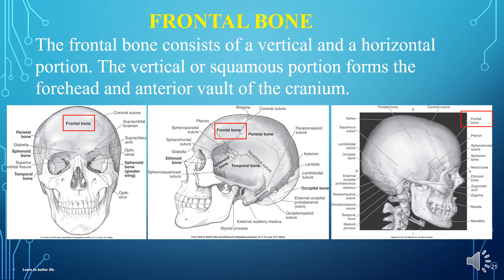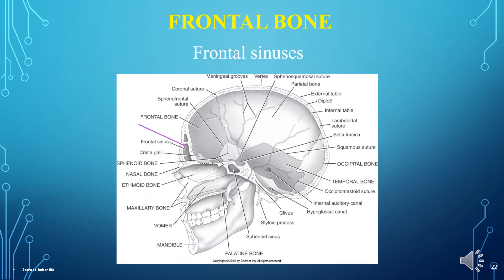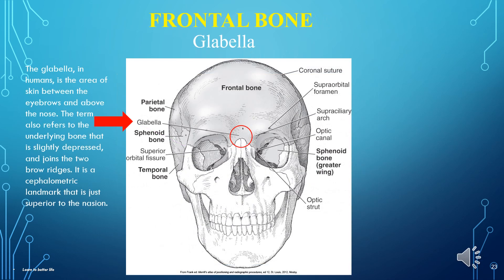Let's look at the frontal bone. The frontal bone consists of a vertical and a horizontal portion. The vertical or squamous portion forms the forehead and the anterior vault of the cranium. The sinuses in the frontal bone are called the frontal sinuses — see the purple arrow. The glabella, in humans, is the area of skin between the eyebrows and above the nose. The term also refers to the underlying bone that is slightly depressed and joins the two brow ridges.